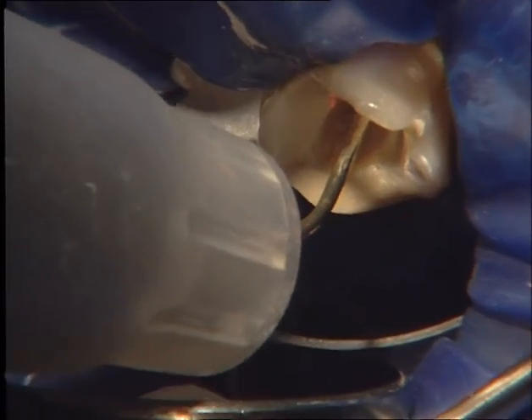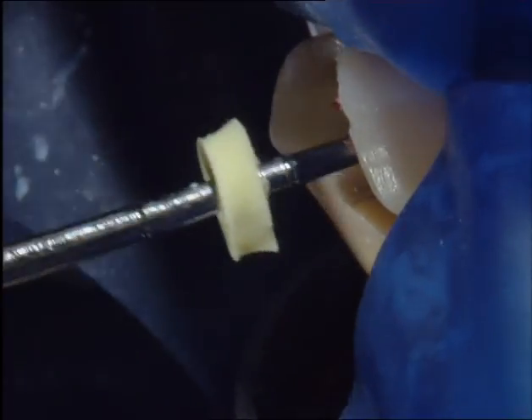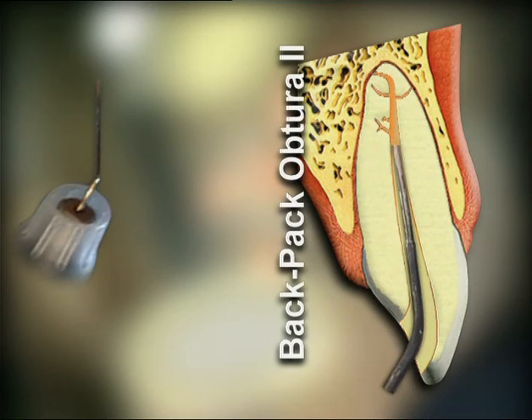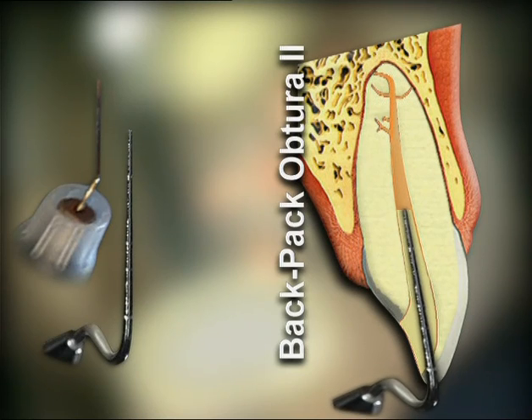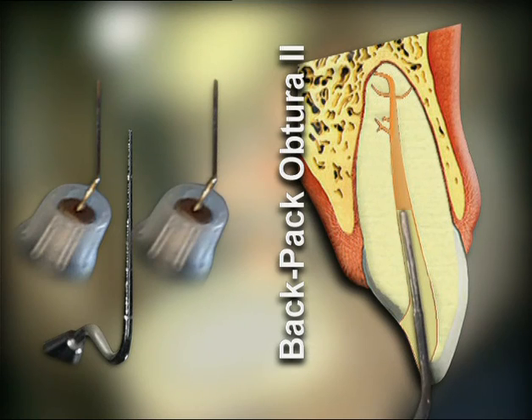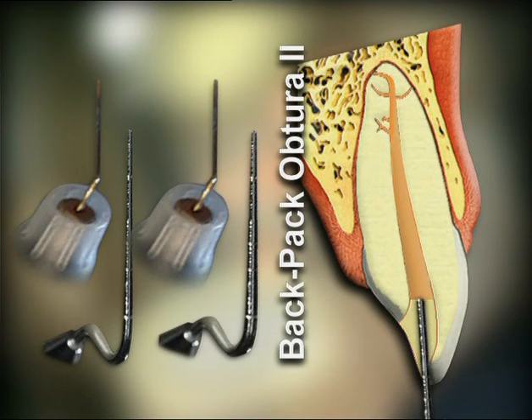The hot, pre-curved needle is inserted into the canal until it comes into contact with previously packed gutta-percha apically. Pluggers are used for compaction. Through a series of gutta-percha injections and vertical compactions, the canal is filled completely step by step. The hot tip of the needle will resoften the most coronal aspect of the apical core of gutta-percha, ensuring cohesion and homogeneity during backpacking procedures.